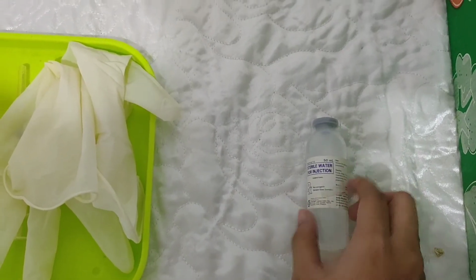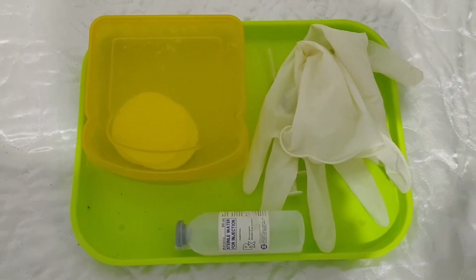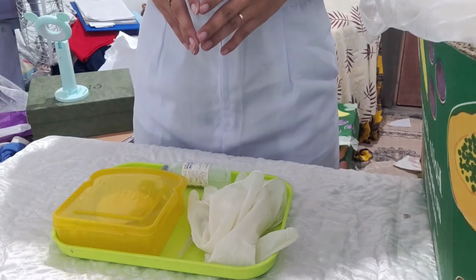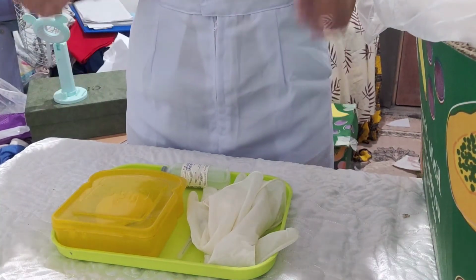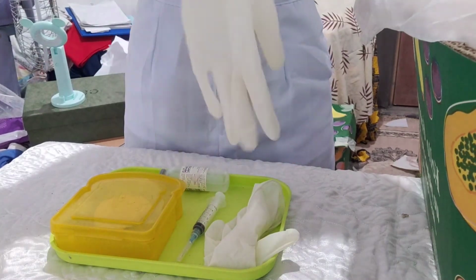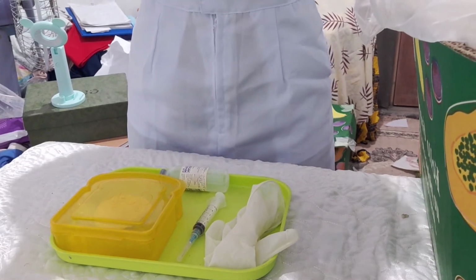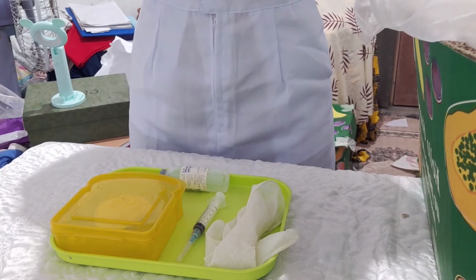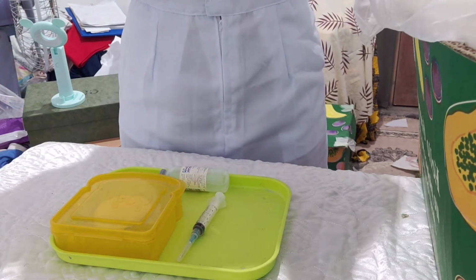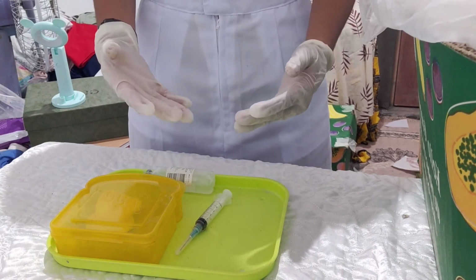Read and also check the label before calculating the dose. Okay, now let's start. Here are the materials that we need. We need the gloves first. Now we are done with the hand gloving.